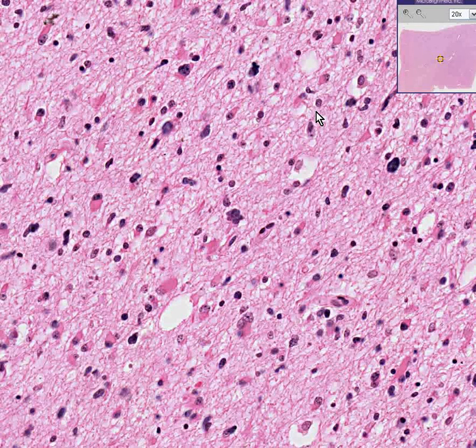Here's one that makes you a little bit worried. And at this point, you no longer have to worry or wonder whether this is reactive glial cells or glioma. This is a glioma. This is what it might look like grossly now that we saw the microscopic first.